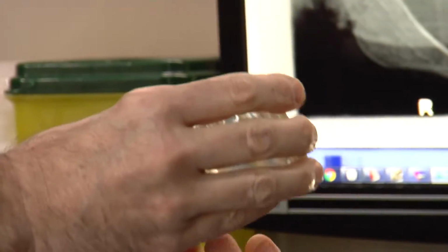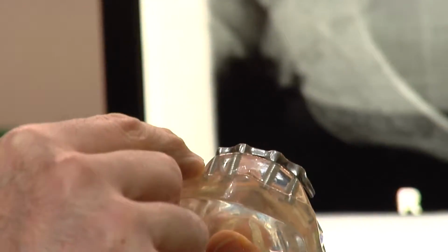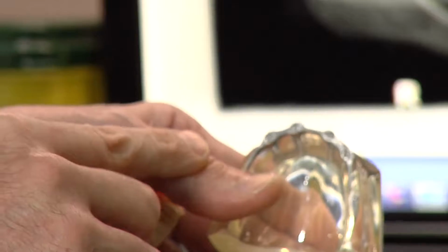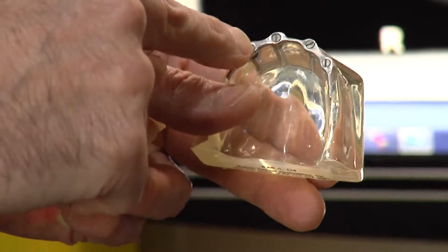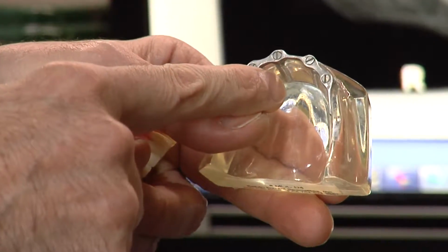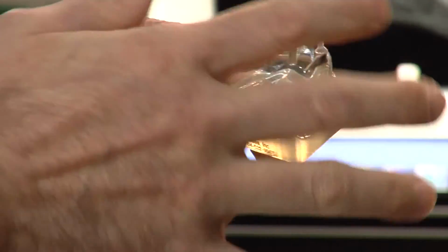And the reason that we can do that is, in this case here, we would have 4 implants placed. And then we have this superstructure here we call a bar. That's the bar. The bar is screwed down into those implants and is not removable. And that goes right into the bone. I'll show you some photographs of that here in a moment, and we'll show you what that actually looks like.